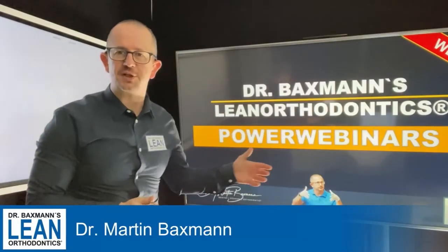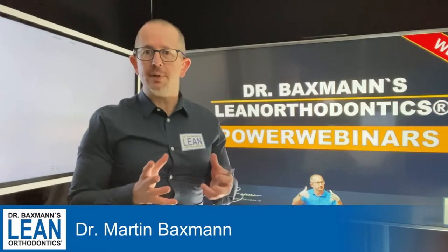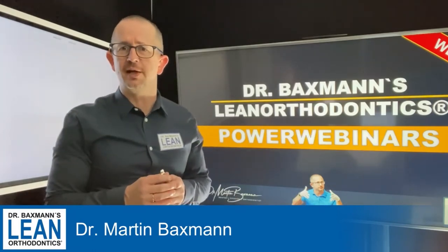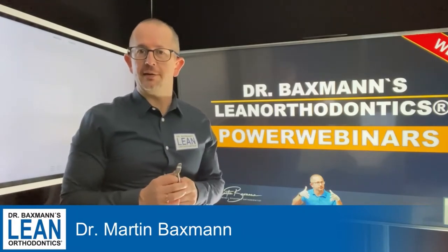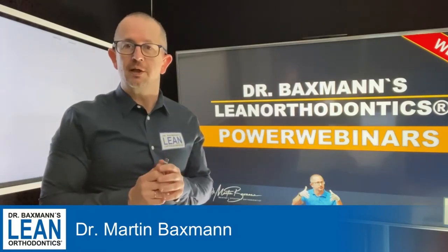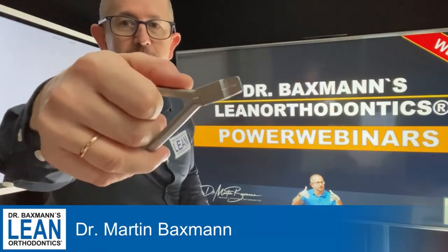Welcome to my power webinar series. My name is Dr. Martin Baxmann, and today it's wire bending time. It may feel like old school wire bending, but it's the toe-in bend and it's very useful for the molars. The wire you'll need is a 17-25 stainless steel wire, and this one here is the tweed plier again.